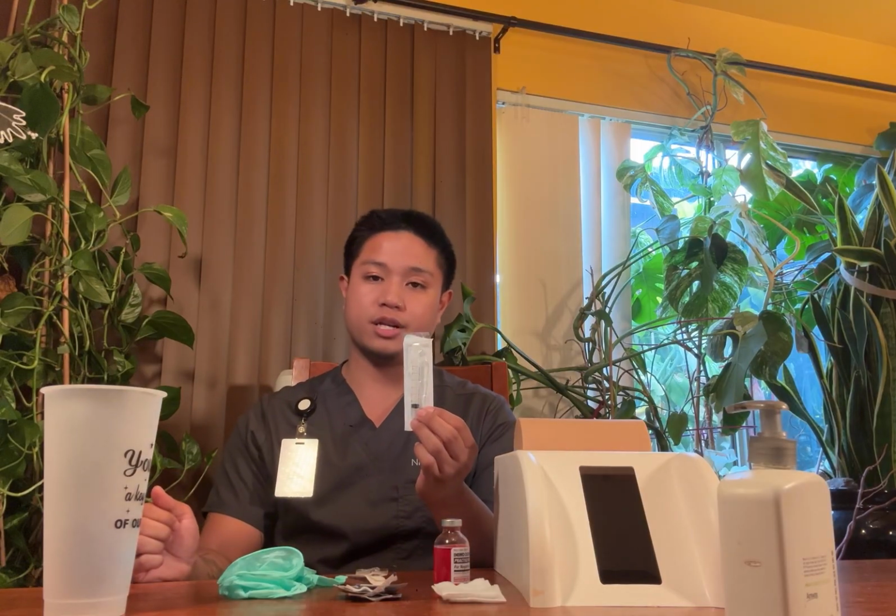This one right here is a 22 to 25 gauge needle, 1 inch to 1.5 inch needle. I have my 3 milliliter syringe. I have my medication vial, which is morphine. I have my alcohol prep pads, my gauze, my gloves, my designated sharps container, and then hand sanitizer for hand hygiene.